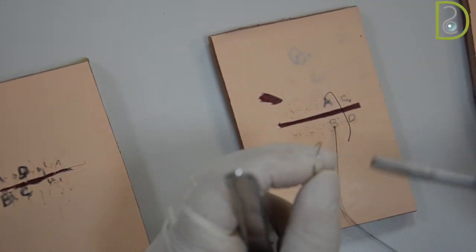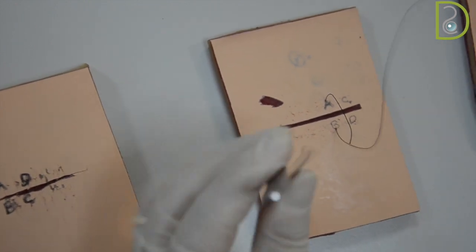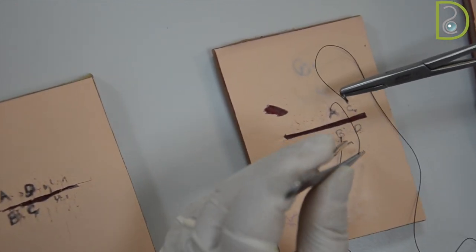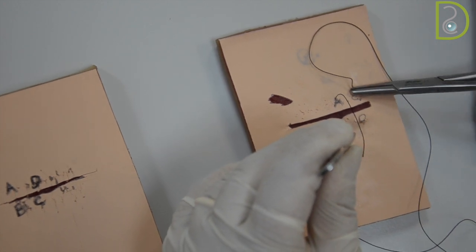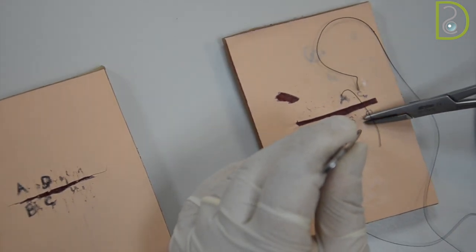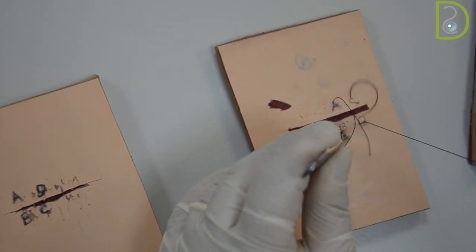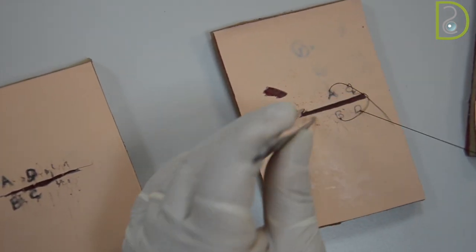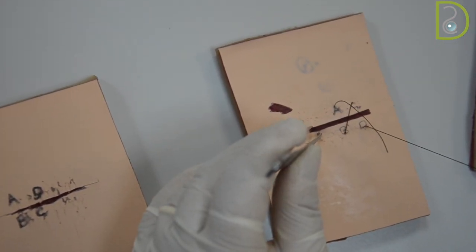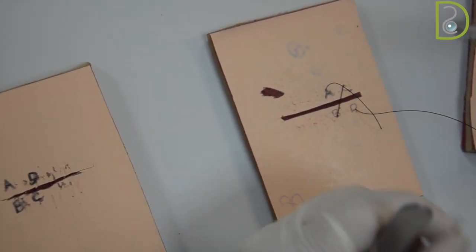Then I will adjust, holding the needle the same way, going towards the buccal again, then taking it out in one step. Hold the tail from the tip so that it will not get grabbed, and make sure the tail will not get tangled.